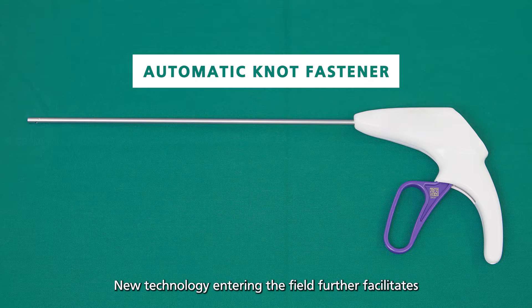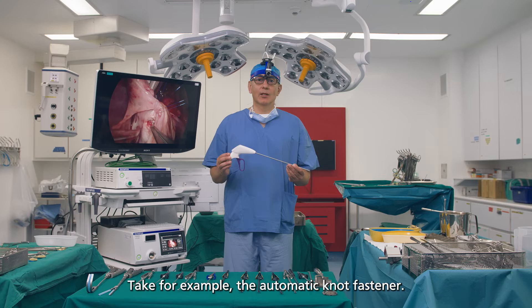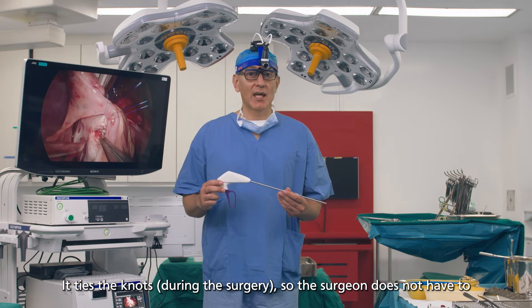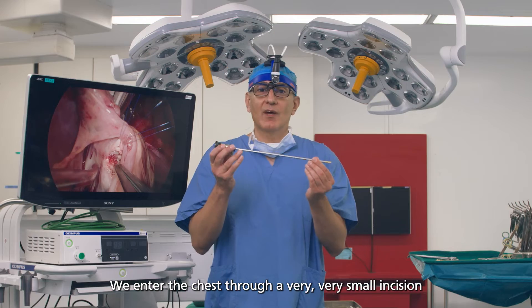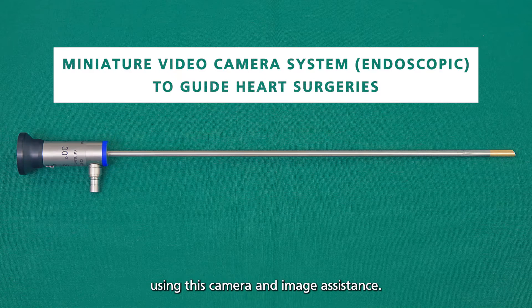They come in different sizes, adaptable to each patient's body and size or weight. New technology entering the field further facilitates minimal invasive and endoscopic heart surgery. Take, for example, the automatic knot fastener — it ties the knots so the surgeon doesn't have to through the very small incisions we make on the chest. We'll enter the chest through a very, very small incision and the entire heart surgery can be done using camera and image assistance.